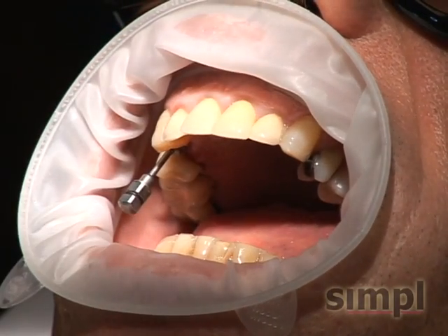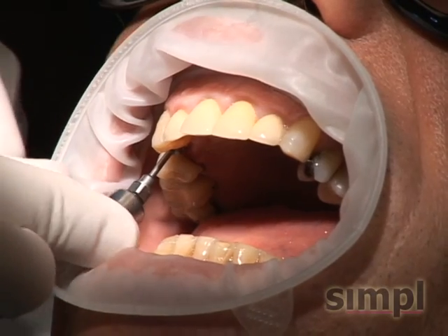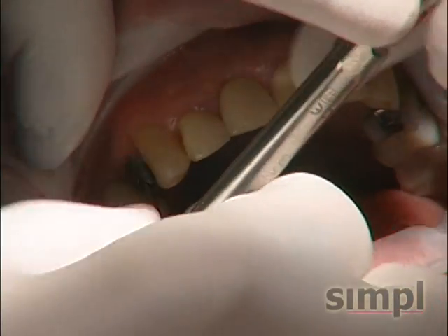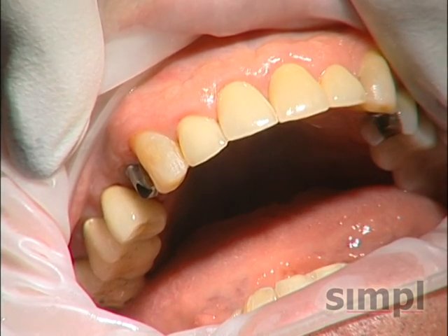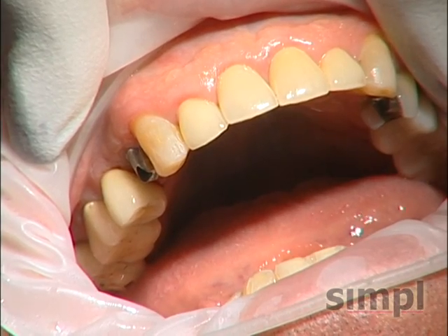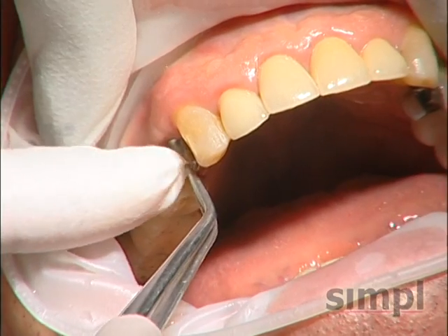Now we are going to torque the abutment in. Torque this down to the manufacturer's recommendation. And we're going to put a little cotton pellet in. Sometimes we use cotton pellets, sometimes we'll use some Cavit G just on the access opening so that cement doesn't get all the way in.